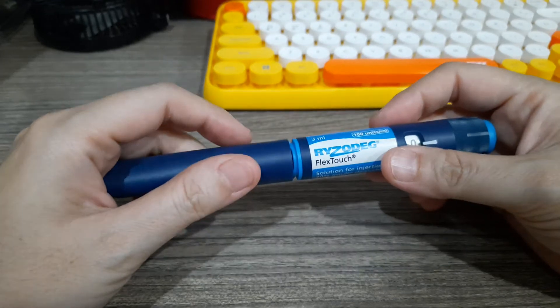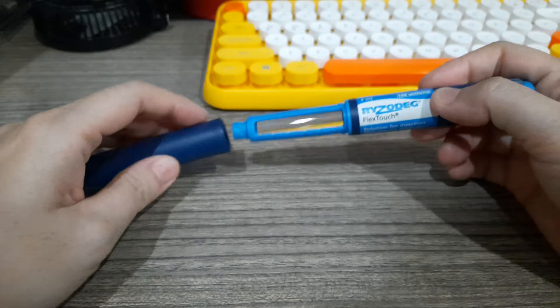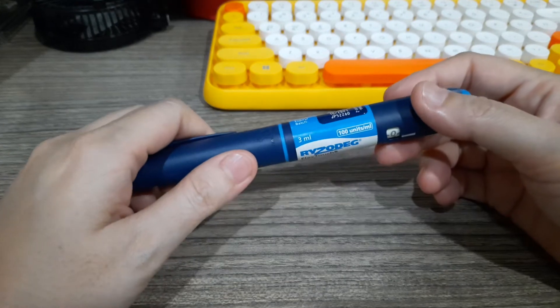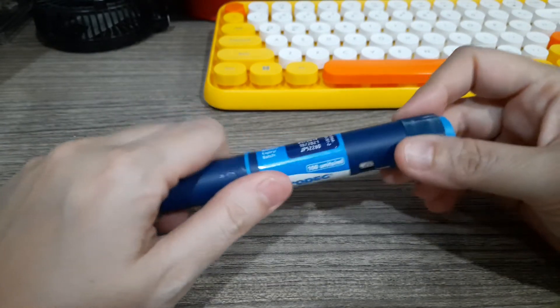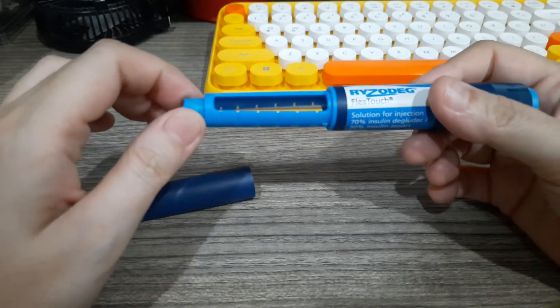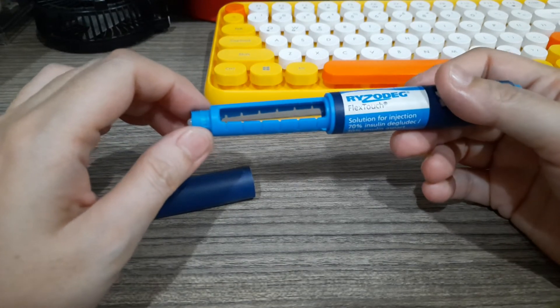In today's video we will discuss how to use a Ryzodeg pen. Before you use it, always check if it's expired. If your physician prescribes you 16 units, notice that your insulin is clear — there's no need to shake it. Your insulin will be stable at room temperature once you open it for about 30 days.